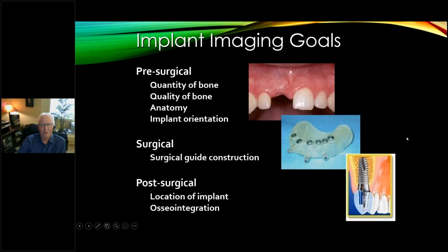For implant planning goals, when I was reading through the recommendations of the AAMR, post-surgical assessment is not very well done in cone beam. Yes, you can do it. There might be some limitations because of scatter artifact and other things. They were suggesting periapical imaging because of the detail, but my feeling is you use whatever modality gives you the information that you need to determine what's happening with that implant.